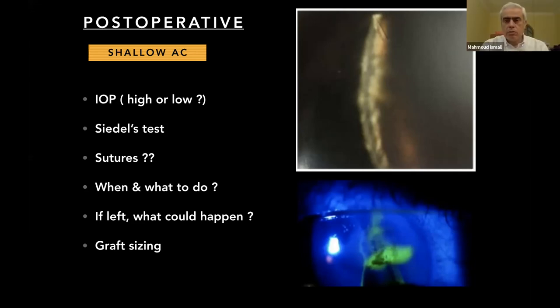As Dr. Gustavo said, I'll put a contact lens, I patch the eye, and I dilate the eye at maximum. Dilatation can help in reforming some of the anterior chamber. And of course, as soon as possible, don't try to do funny things in the clinic, because injecting air inside the anterior chamber in the clinic is heroic, and I don't advise anybody to do it.